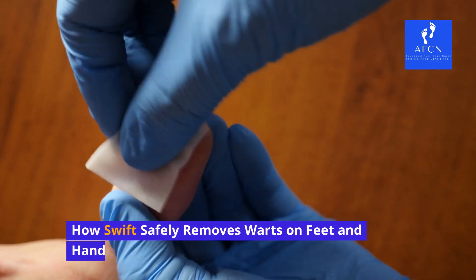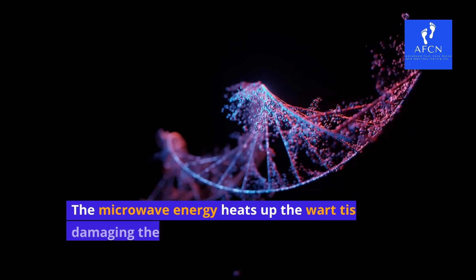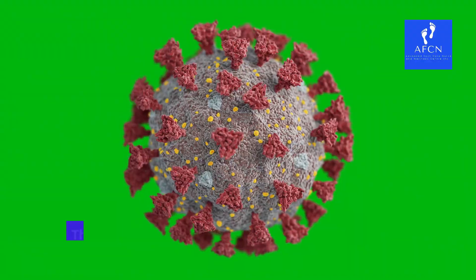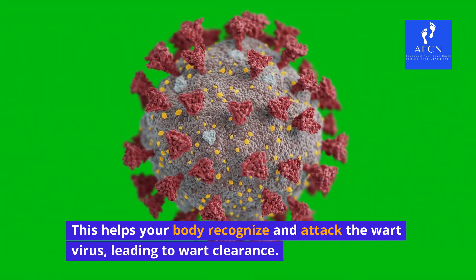How Swift safely removes warts on feet and hands. Swift Microwave Therapy uses targeted microwave energy to treat warts. The microwave energy heats up the wart tissue, damaging the DNA of the wart virus and stimulating an immune response. This helps your body recognize and attack the wart virus, leading to wart clearance.